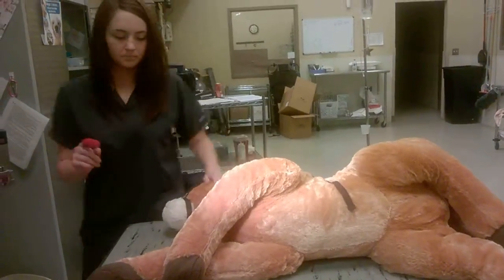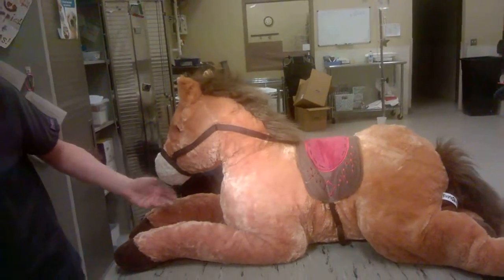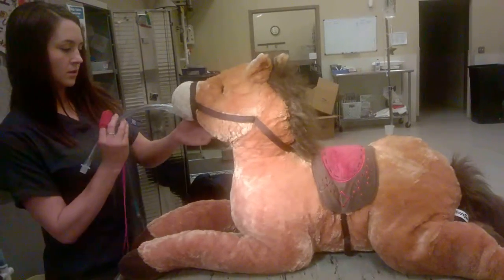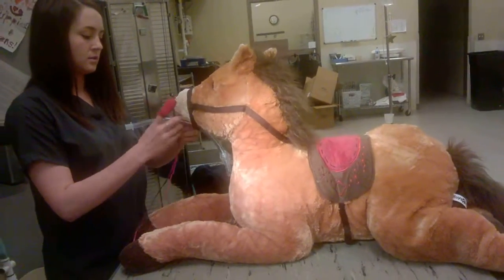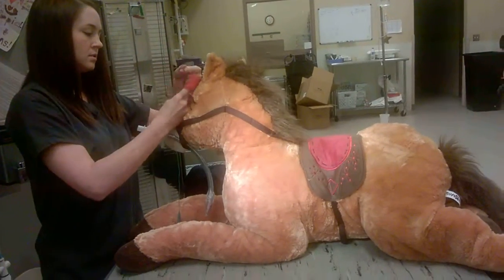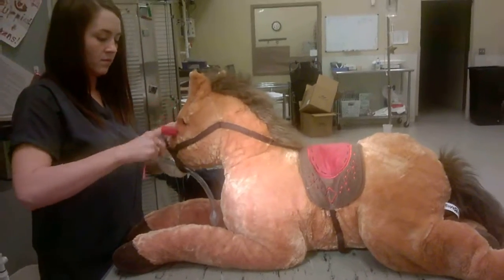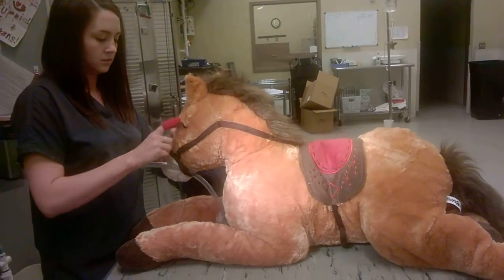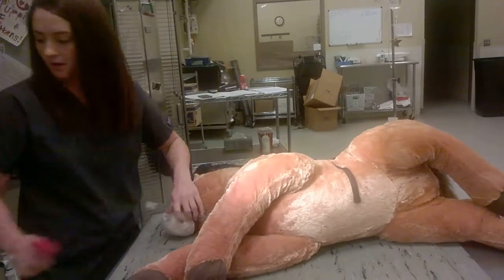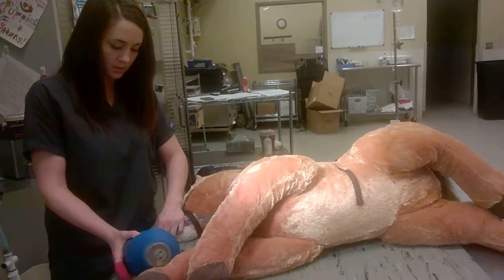At this point, I'm going to tube the patient. Get right into the trachea, tie it in. Place him back in right lateral recumbency, place the ambu bag on there, and two more big breaths.